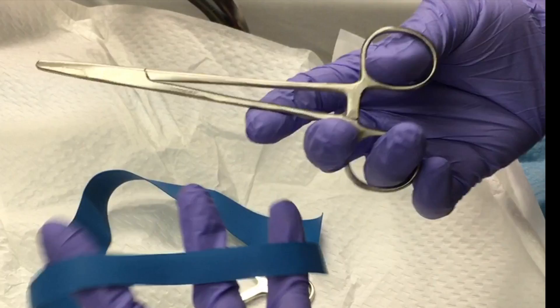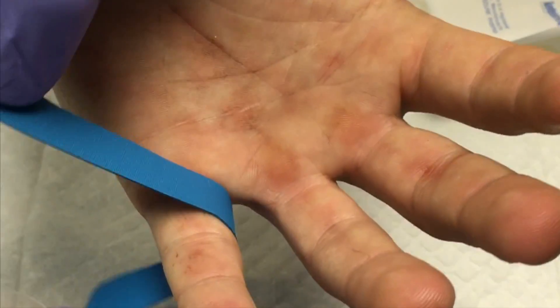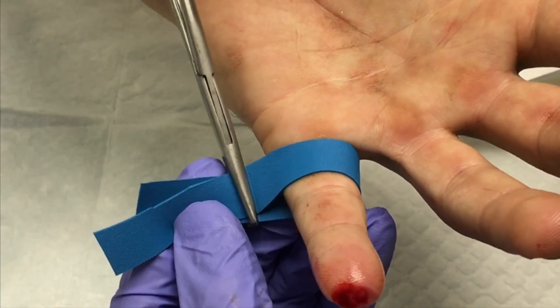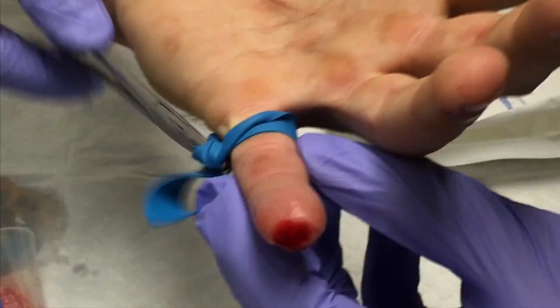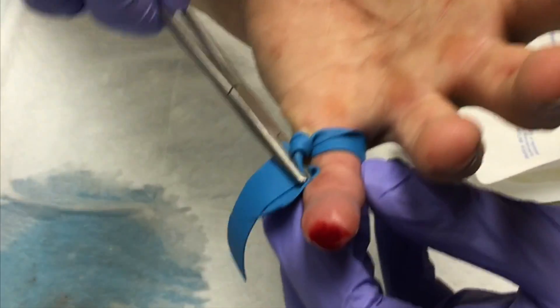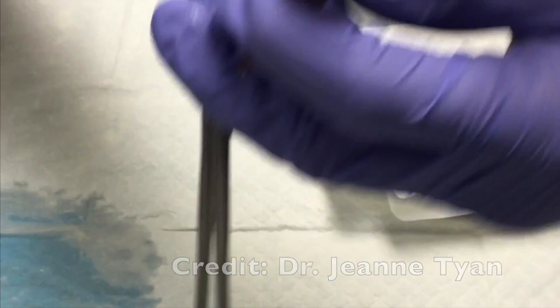Here's a trick: take a sliver of a tourniquet, cut as shown, and use a pair of hemostats or needle drivers. Place that piece of tourniquet around the finger and secure the needle driver around it. Then simply crank it up to a level that's just right — enough to get hemostasis, but not so much that the patient can't tolerate it.